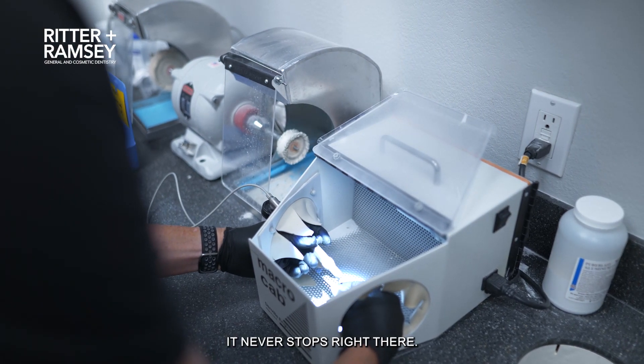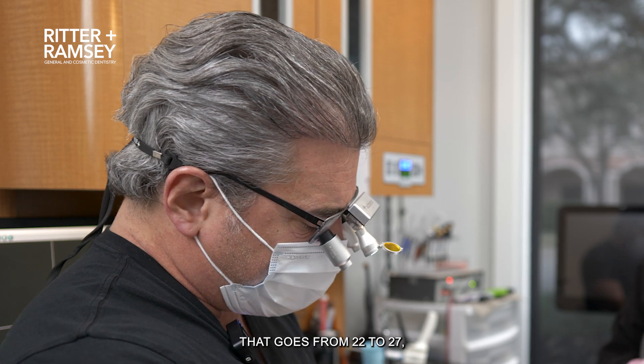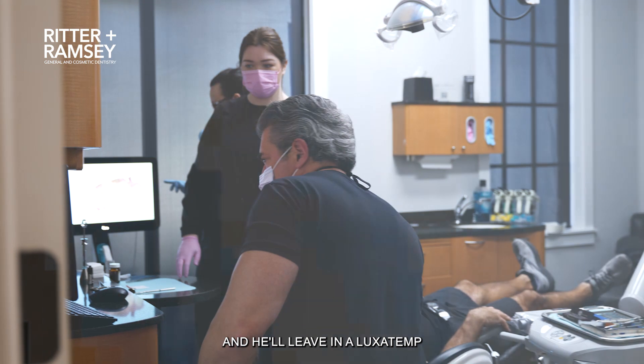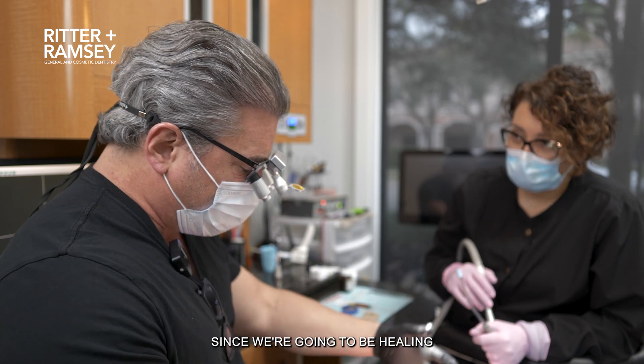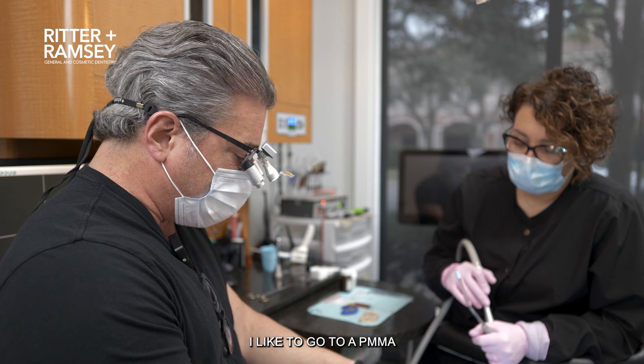But the truth is, for us, it never stops right there. He will leave in a temporary that goes from 22 to 27, even after we have 23 through 26 removed. He'll leave in a luxatemp — it's a great material for right now. But I like for long term, since we're going to be healing six to eight weeks from both a function and aesthetics standpoint, I like to go to a PMMA.